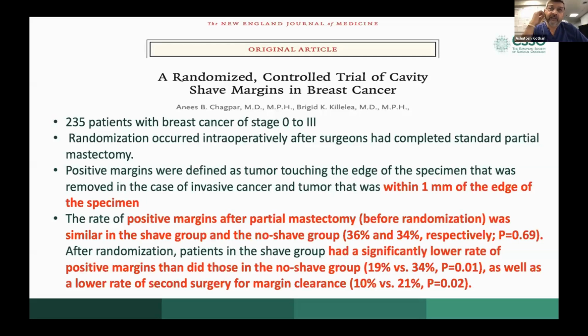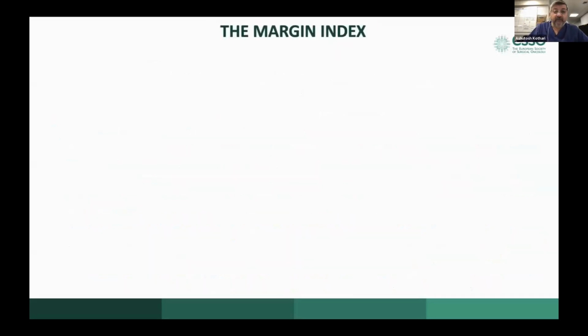But in the world of oncoplastic breast surgery, where less is more, I think this goes against what we are trying to do. We are trying to move towards conservatism and remove just enough tissue and not go back and just take chunks of tissue. And in 50% of them, they won't be involved. So I don't think this is a very sensible thing to do in terms of today's situation. But if it is part of your practice, then it will reduce your re-excision rate by 50%.